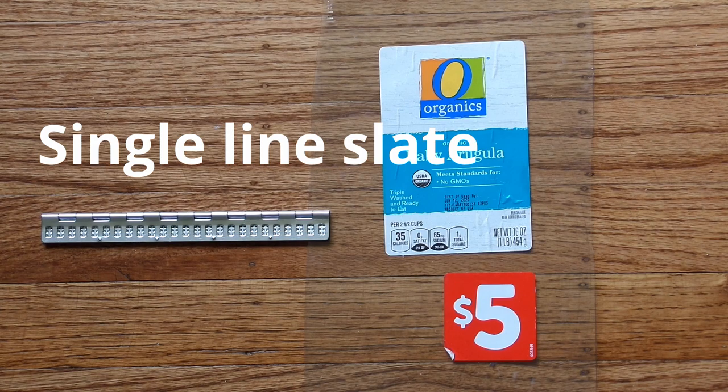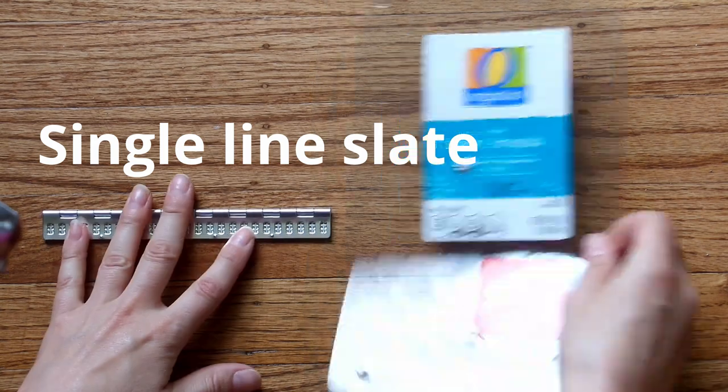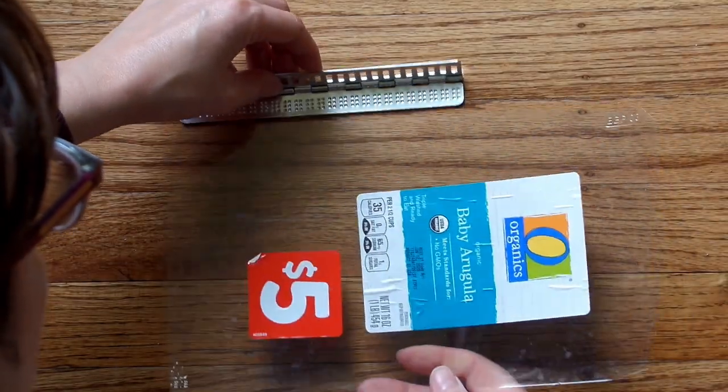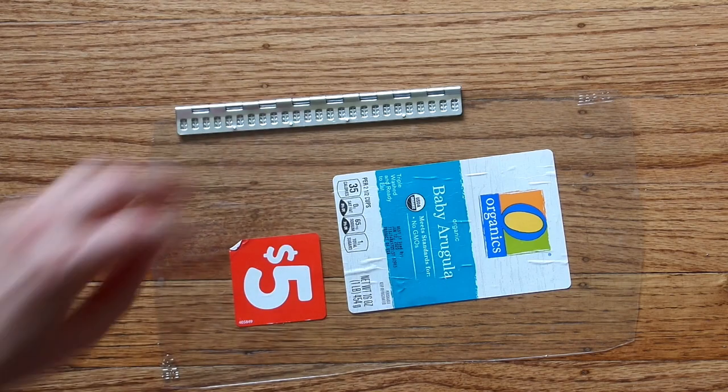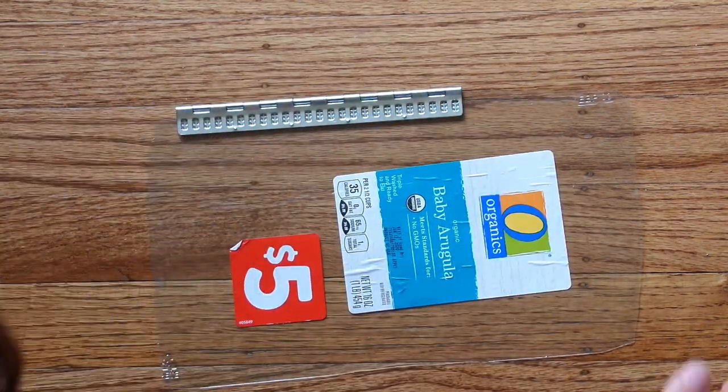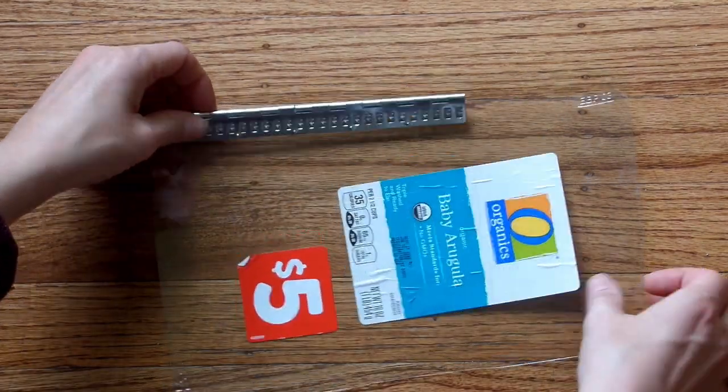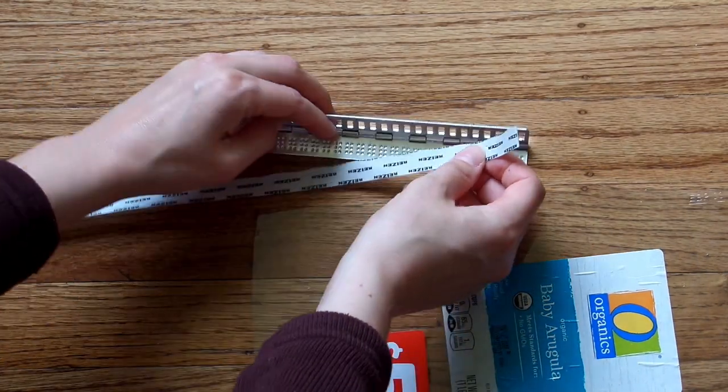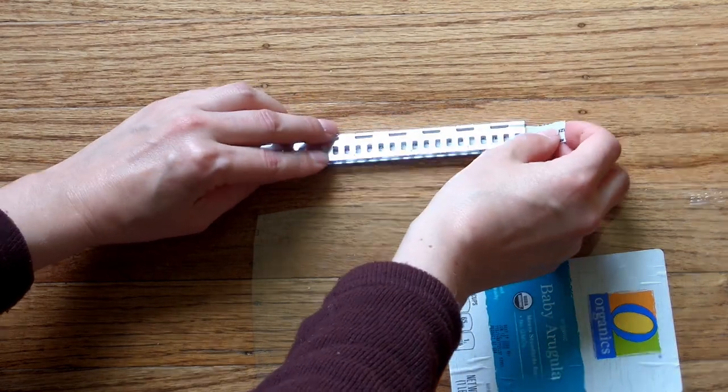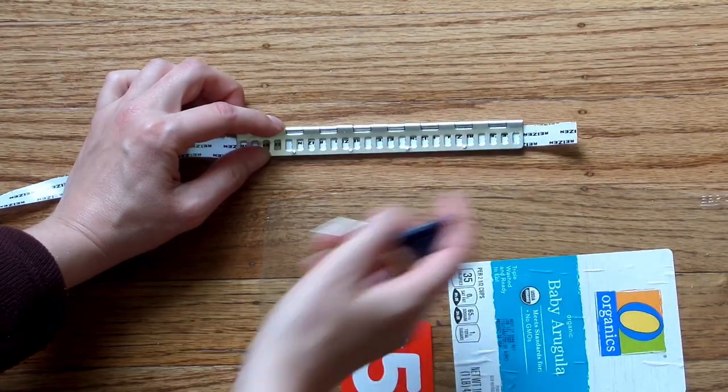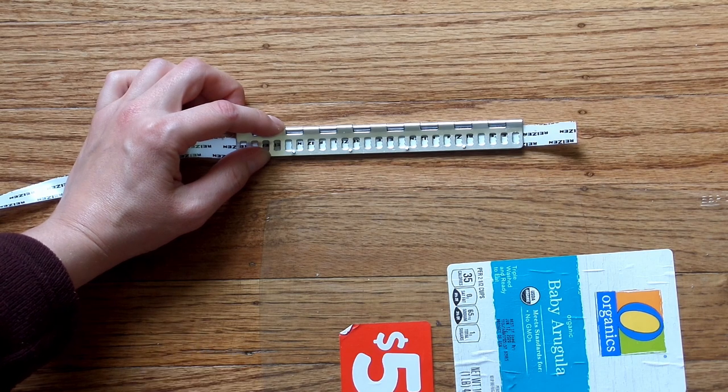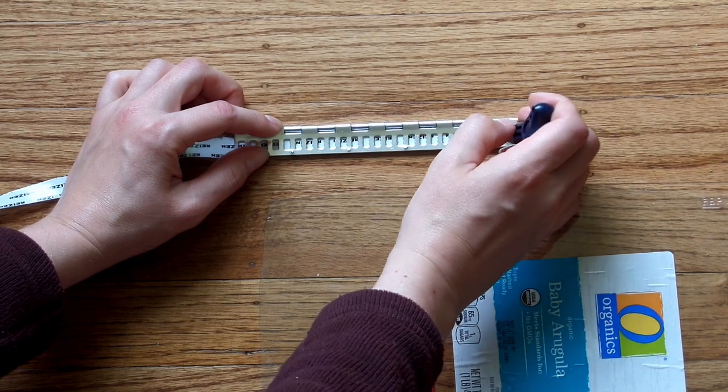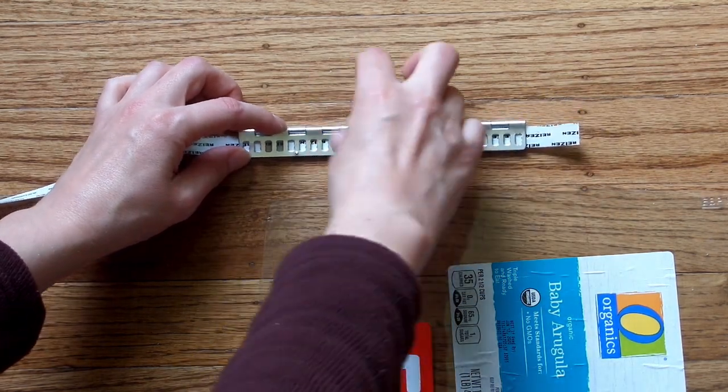So this is a one-line slate specifically designed for writing labels. I could take this plastic salad lid, put it in the slate, and then just start writing right to left. So this is a 25-cell slate. You can take label tape, if you don't want to make your own, and just put it in the slate. Make sure the label is in there backwards, because you are writing on the back side of the label. And then just go ahead and start punching your labels.